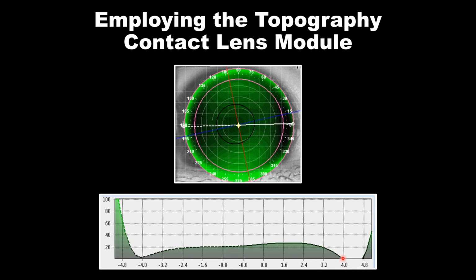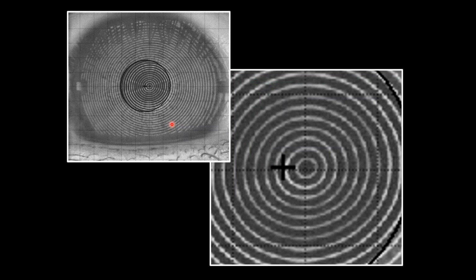It needs to sink below the epithelium on the temporal side, which of course can't happen, but the topographer is trying to deal with the fact that all of this data in here is exceptionally flat all of a sudden, whereas on the temporal side, it's dealing with much steeper curvature. So the problem really exists that we have not centered the topography to the geometric axis.